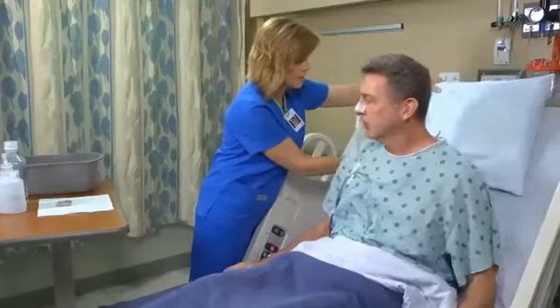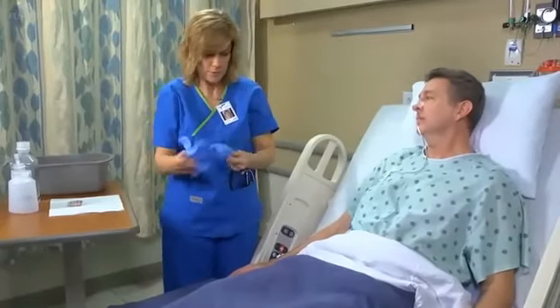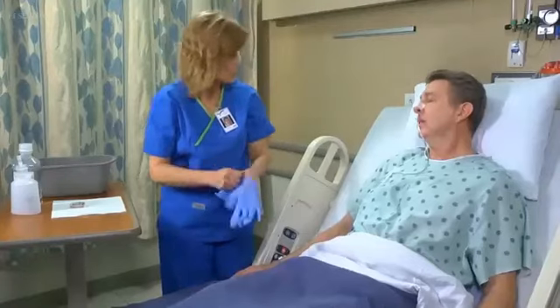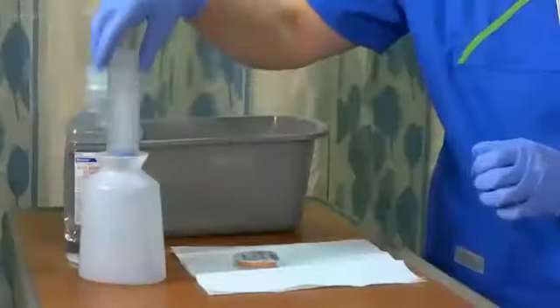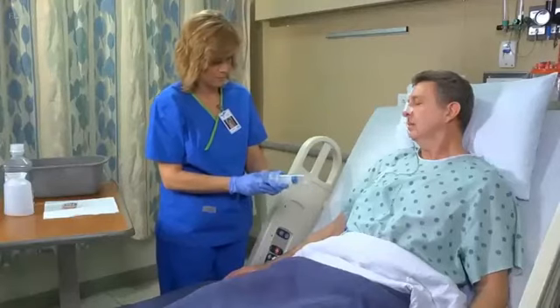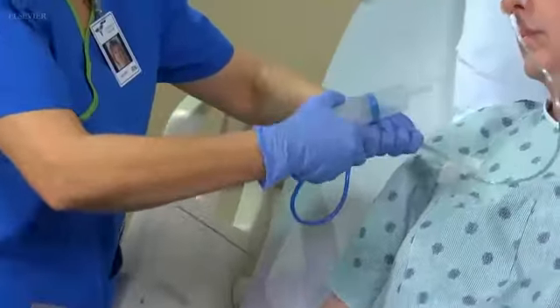All right, you can lean on back. Okay. I'll put some gloves on now. What I'm going to be doing is checking placement of that tube in your stomach. To obtain aspirate, begin by drawing 30 milliliters of air into a 60 milliliter syringe. Attach the syringe to the end of the feeding tube.